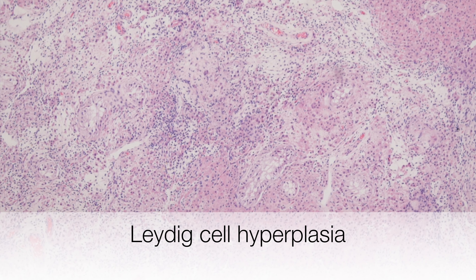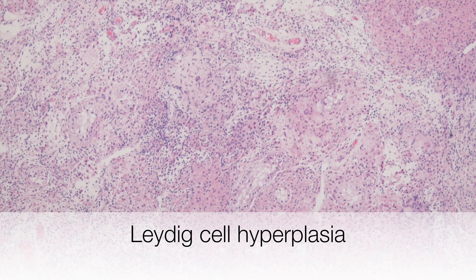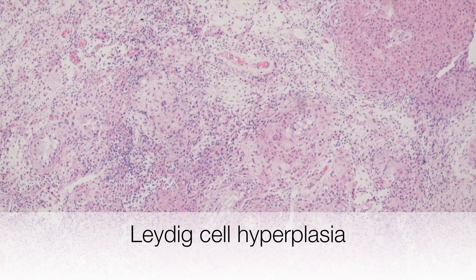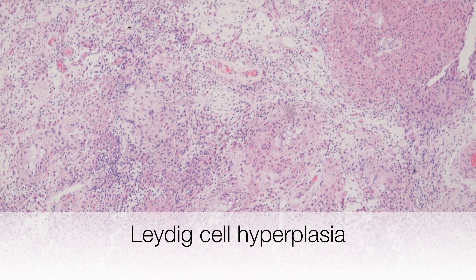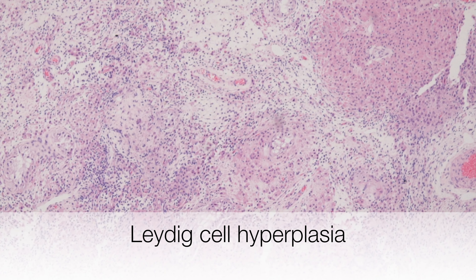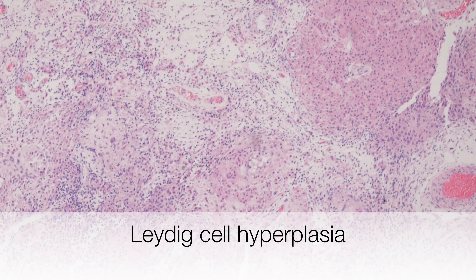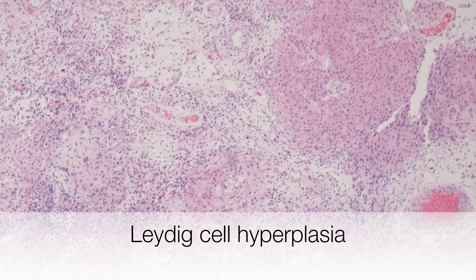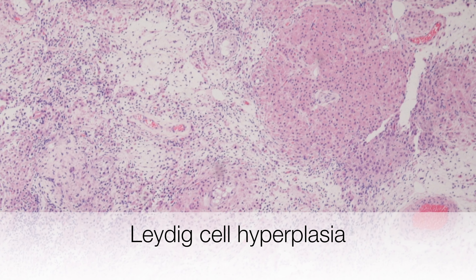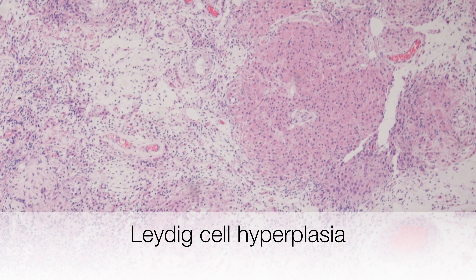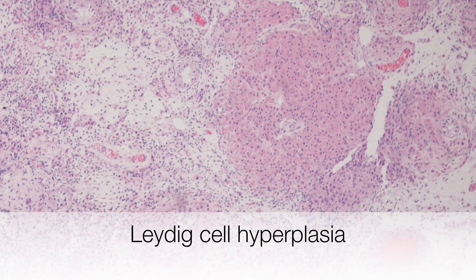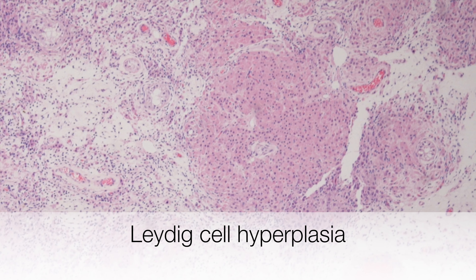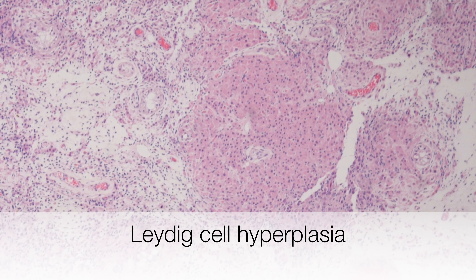The main differential diagnosis of a Leydig cell tumour is Leydig cell hyperplasia. Here is an example of Leydig cell hyperplasia. Leydig cell tumours have sharply circumscribed margins, but in this example of Leydig cell hyperplasia you can see rather ill-defined nodules of hyperplastic Leydig cells.